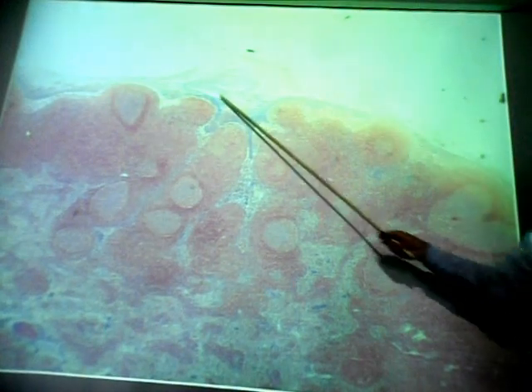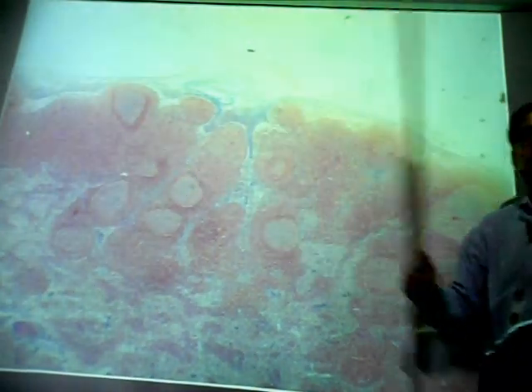This, of course, is a section through the lymph node, which hopefully looks familiar. And several things you should be able to recognize. And again, this is right off your objective sheet. First off, the connective tissue membrane that surrounds this organ and also many other organs. It's shown here in blue. What is this? Capsule. That is the capsule.